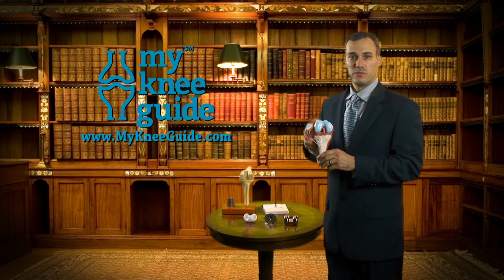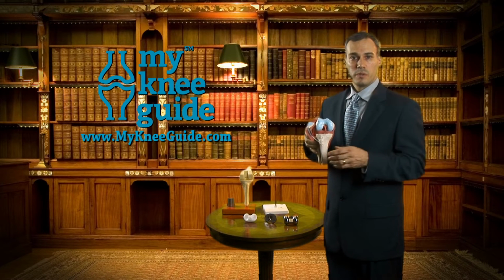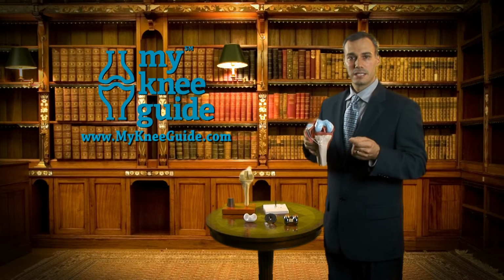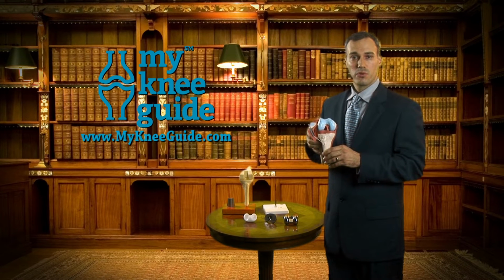Your surgeon will use various jigs and guides along the bone in order to resect any remaining cartilage and small pieces of bone. This will be done in order to give good access now and space to the knee components. Additionally, these guides will allow the surgeon to properly align the new knee replacement.